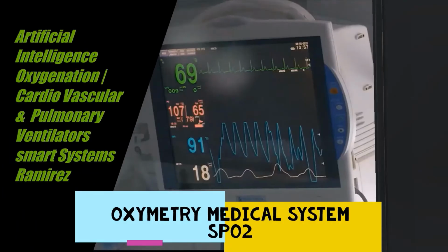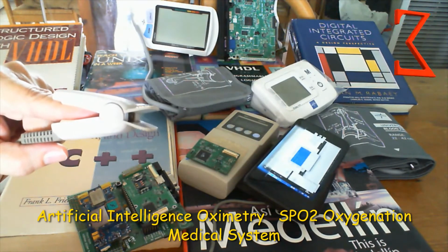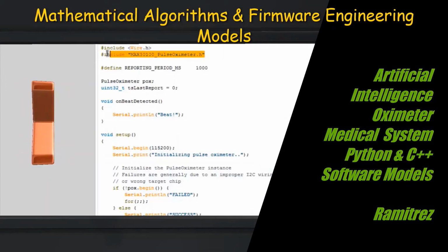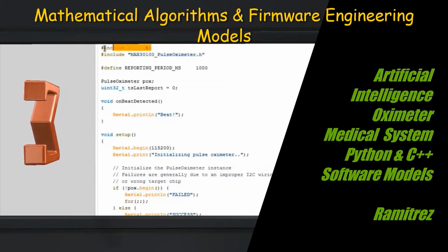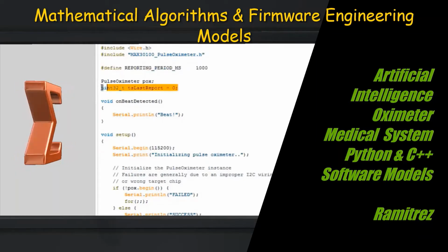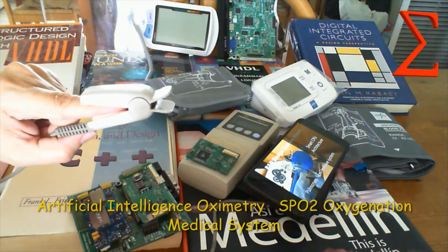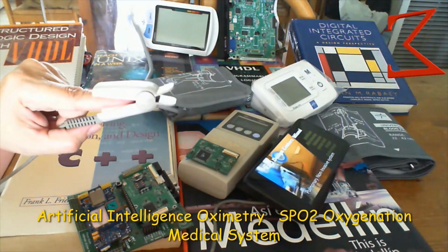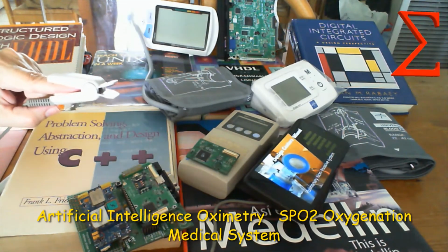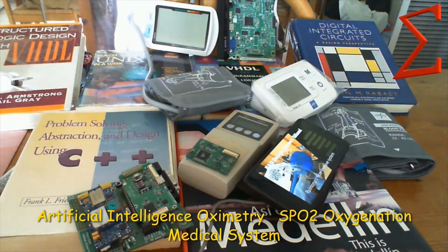In Python, the numerical toolbox SciPy includes NumPy and Matplotlib library. NumPy, which is a utility routine, reshaped the output to a matrix and later plotted with the use of Matplotlib library for use to import suitable filters and filtering techniques.